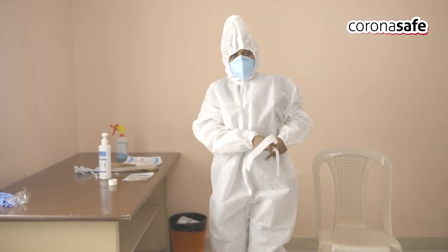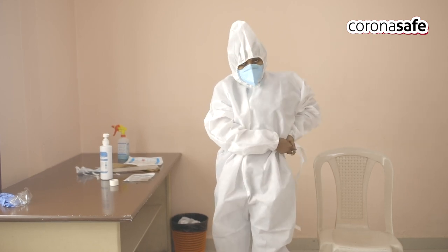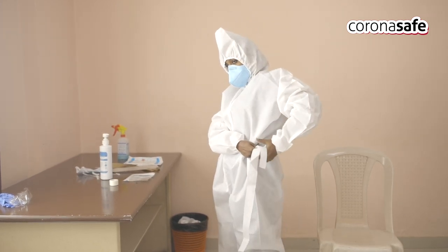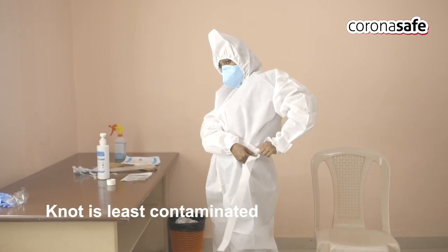Next, the lace at the back of the coverall should be tied at the waist and secured so that the knot comes at the side and back of the body — not at the front — so that the knot is least contaminated.